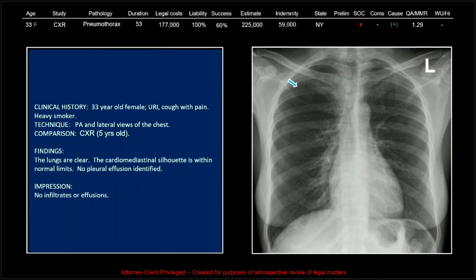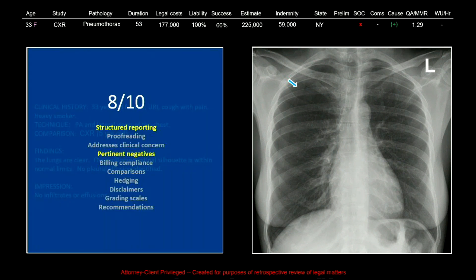This is the only case of a missed pneumothorax, and one of the chest X-ray cases that we had. This one actually was not a big payout — the indemnity was only $59,000. We read it as normal, but there clearly is a fairly sizable pneumothorax on the right. It got an 8 out of 10, dinged for structured reporting and a lack of pertinent negatives.